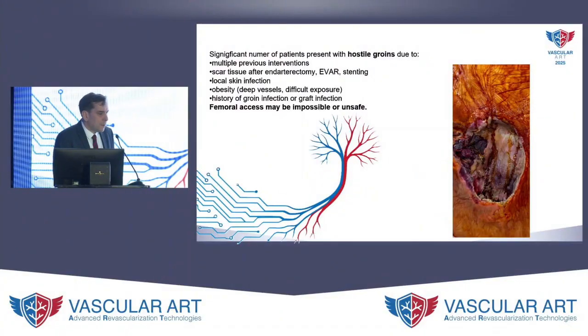For example, if you want to prepare them for surgery, it's much easier to go with the flow in the iliac region and to open a CTO and then convert to the groin which is prepared. Because if you go up retrograde in the iliac lesions, it's very easy to make a dissection, which does not happen when you go down. I don't know why, but that's the fact.